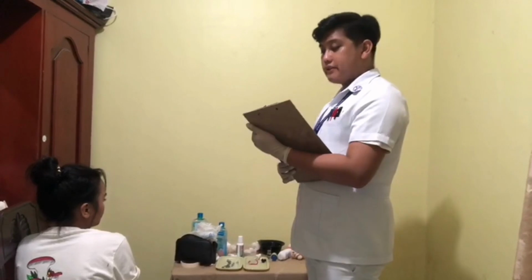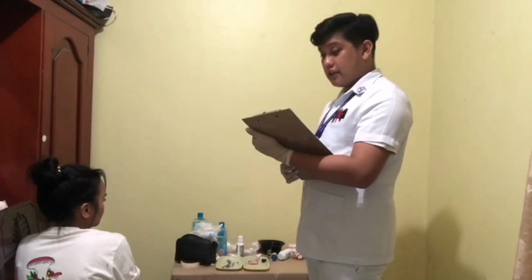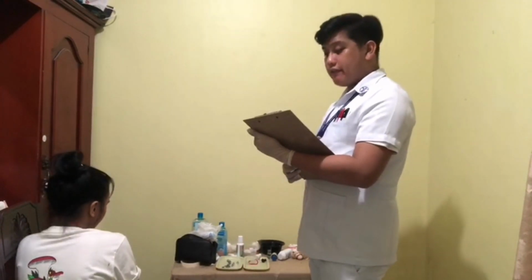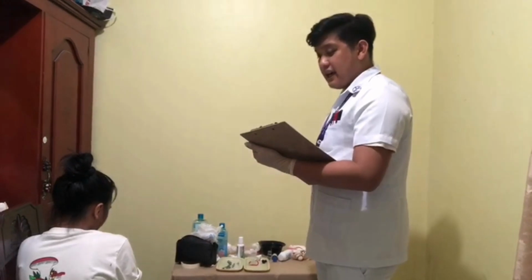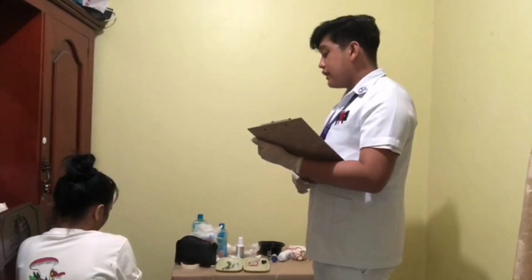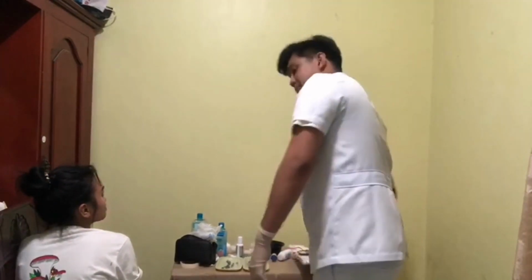So we'll be administering this via your deltoid muscle. So the medication ordered for you is penicillin, which is an antibiotic prescribed to treat susceptible bacterial infection. So this may cause side effects like drowsiness, nausea, vomiting, or abdominal pain. So if you have any concern, ma'am, feel free to raise it. Okay po? Thank you. So now, next we'll position our patient comfortably.